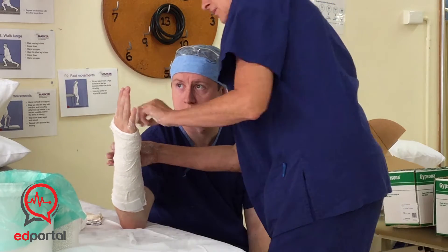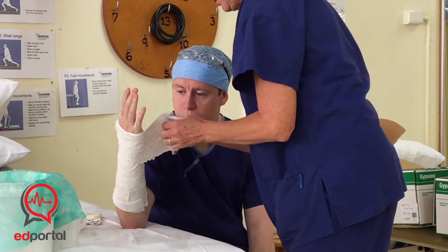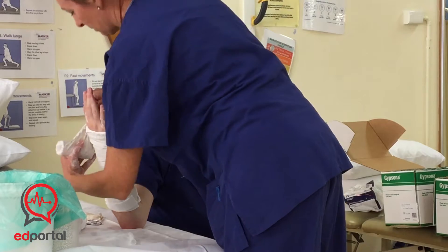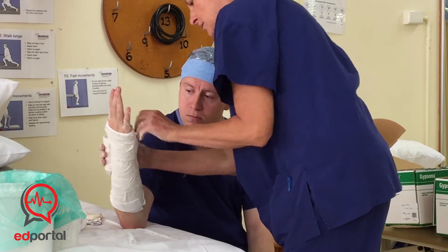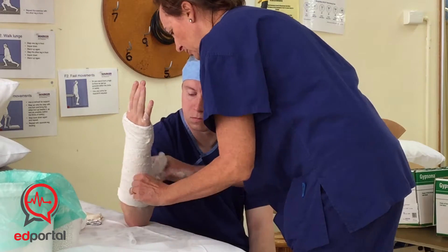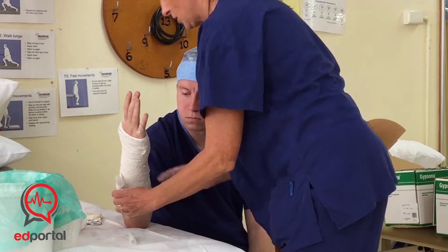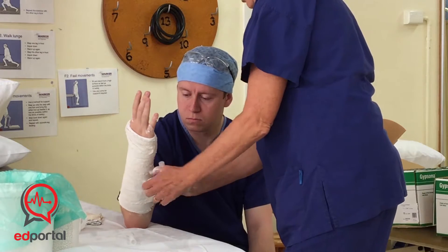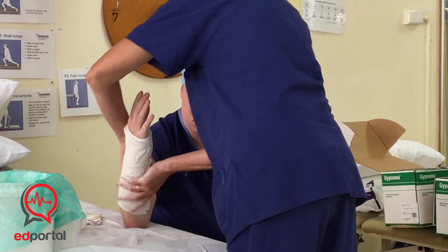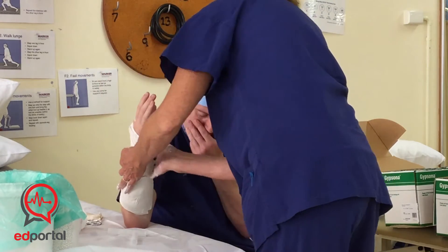Then it's just draping it around — you can pick it up and drape it around like that. If it's snappy, it doesn't matter, you can squeeze it back out. It's twice through the web space with roll number one and twice with roll number two, then just rolling to the bottom. Don't roll off at the very bottom — keep rolling and bring it back up again for even coverage. Now you can smooth it — smooth it in one direction rather than up and down, as that will rub the joints out.